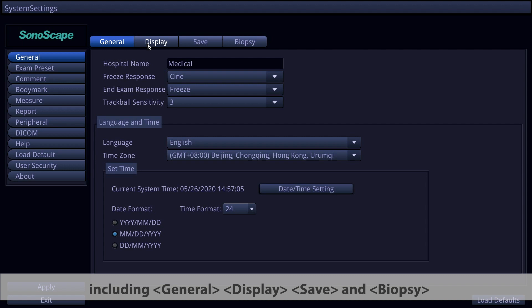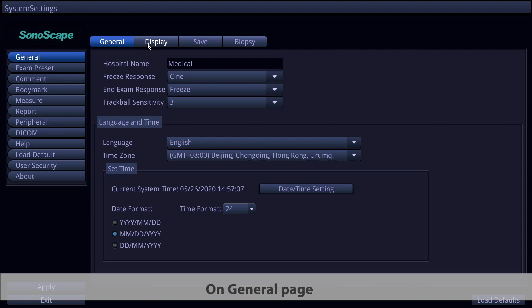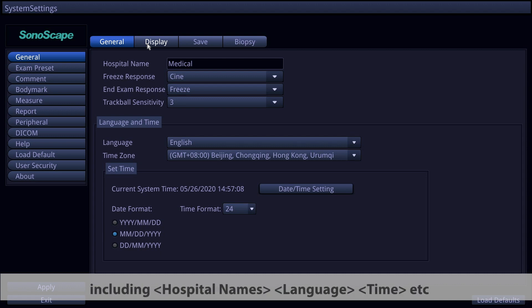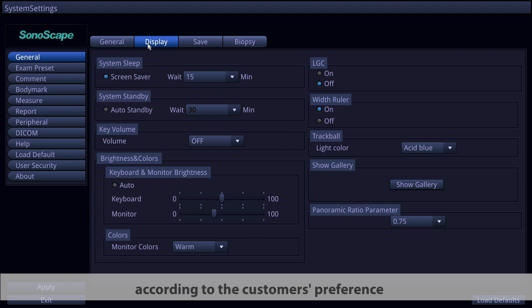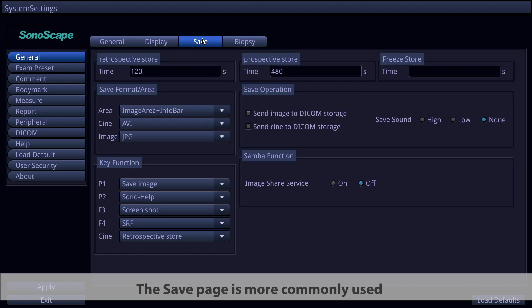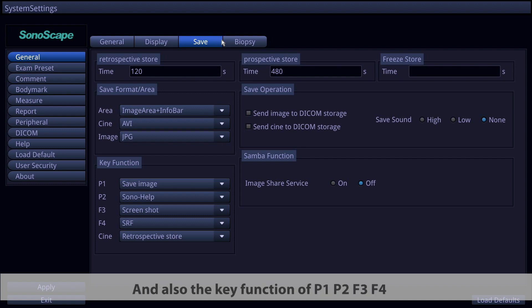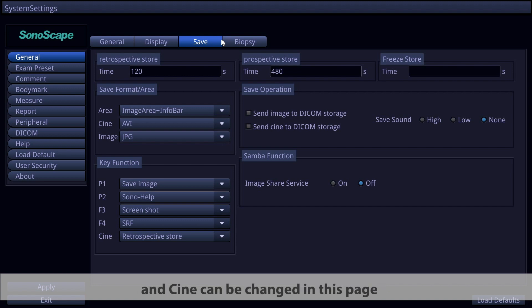First is General Settings, with four pages: General, Display, Save, and Biopsy. The General page covers hospital name, language, time, etc. The Display page lets you change display preferences. The Save page — most commonly used — lets you change storage settings, key functions for P1, P2, F3, and F4, and cine settings.